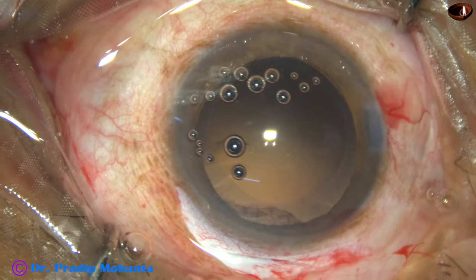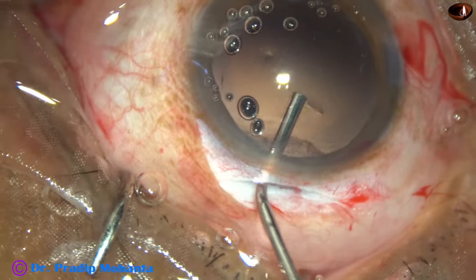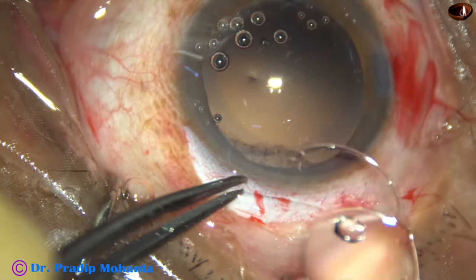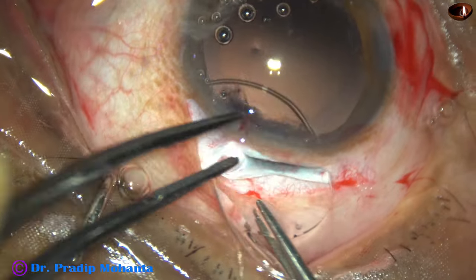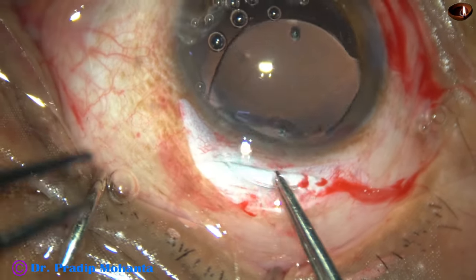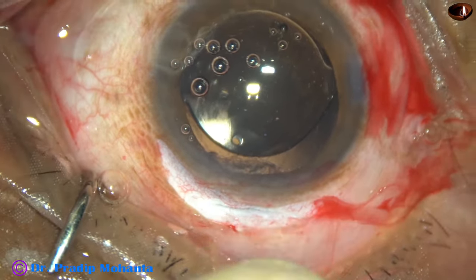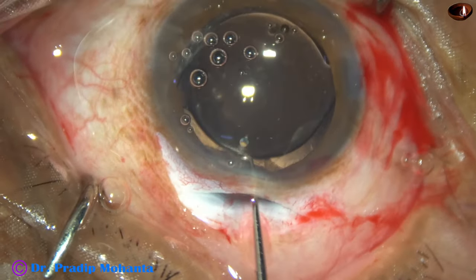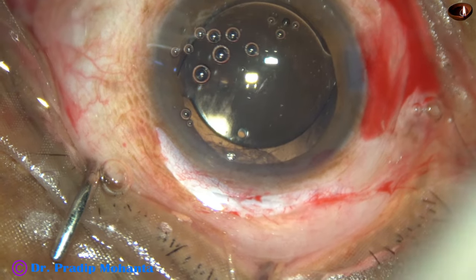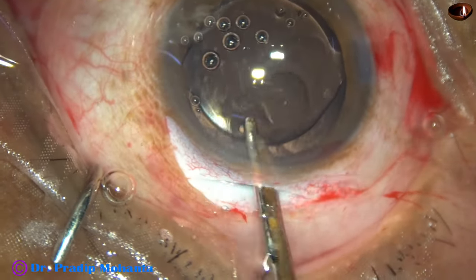SICS is a very nice surgery, and if we place the wound on the steep axis, we can control the existing astigmatism very nicely by SICS. Now this is a PMMA lens, 6 millimeter optic. We need to have a forceps in the left hand, and in this way the lens is placed in the capsular bag. And now we just have to remove the visco from the capsular bag, from the anterior chamber, and from the anterior chamber angle, and we are done.